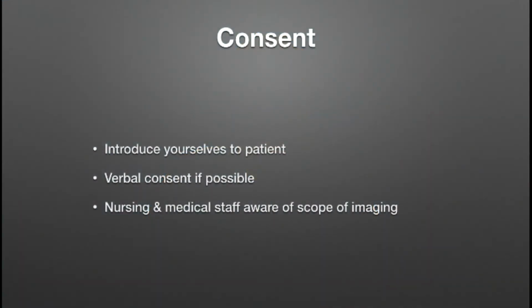In regard to consent for doing a focused cardiac ultrasound, I think it's important to introduce yourself to a patient just as you do every time you examine them, and that's whether they're sedated, ventilated, or awake and talking to you. I think it's important to try and get verbal consent if you can for doing this procedure, and it's important to let them know that if you are training in focused cardiac ultrasound, that these studies are part of that training process.